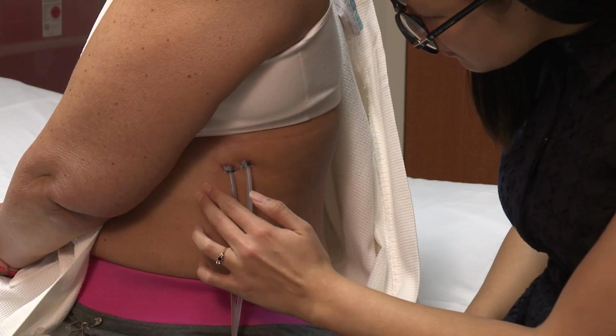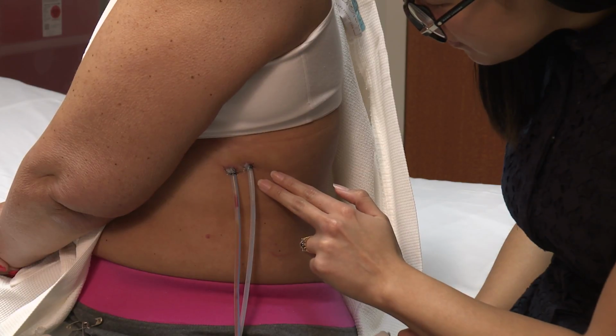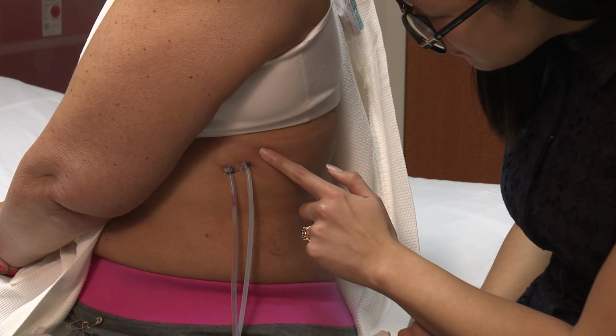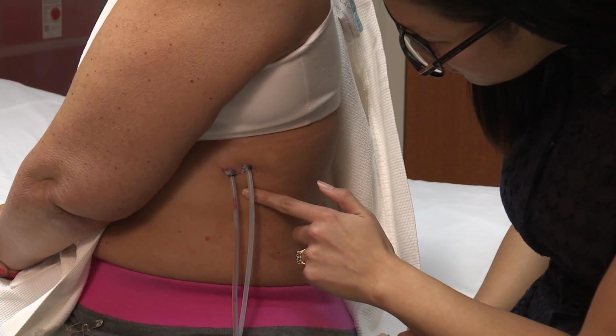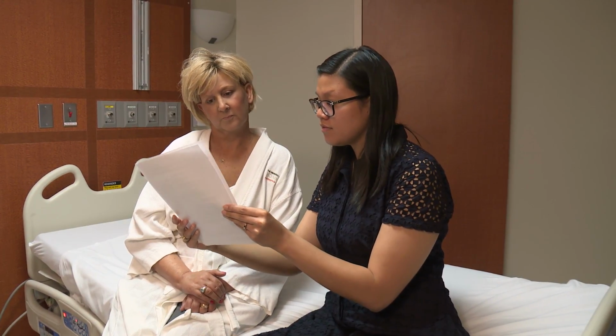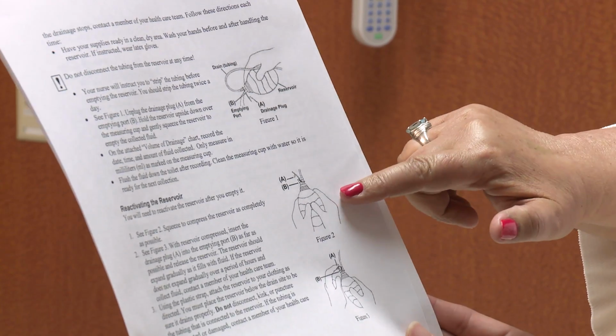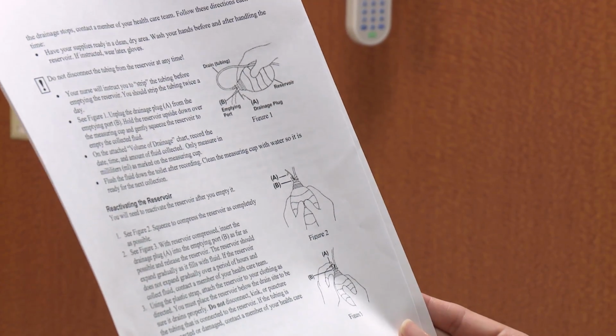You need to be aware of potential problems at the drain site and of any signs of infection. It is important that you call the breast center if you notice any problems. Before you are discharged, you are given a handout reviewing these instructions. It has care instructions specific to your drains and surgical incisions. The handout has phone numbers for you to call if you have concerns.